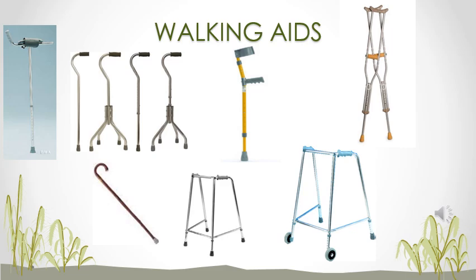Next to it, to its right, is a cane quadrupod, where it has 4 legs at the bottom. Next to it is a crutch, and then to the far right, the top of the slide, is what we call axillary crutches because they fit underneath the axilla.